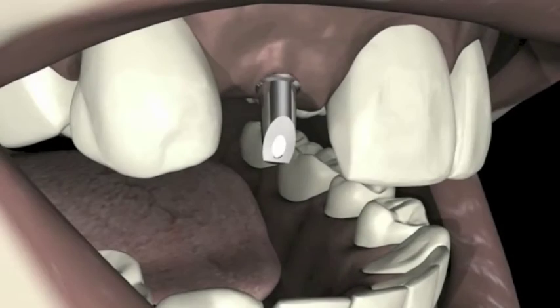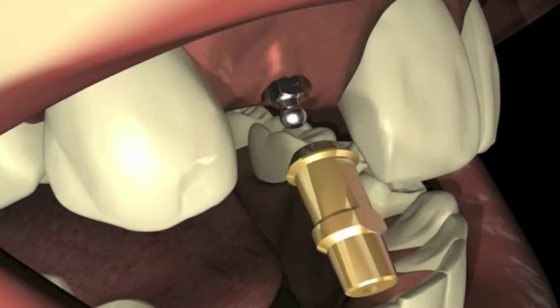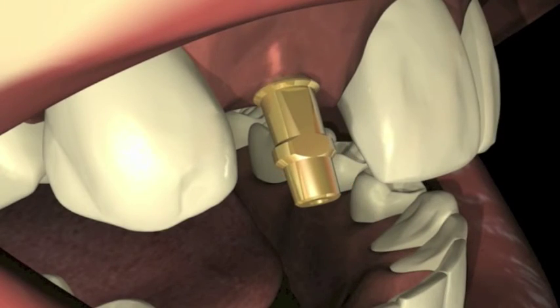Once the placement of the implant has been accomplished, the prosthetic component of choice is now ready for use. In this instance, the final restoration will be made using the Milo straight cementable abutment. A Milo pickup impression coping is snapped over the O-ball implant assembly.